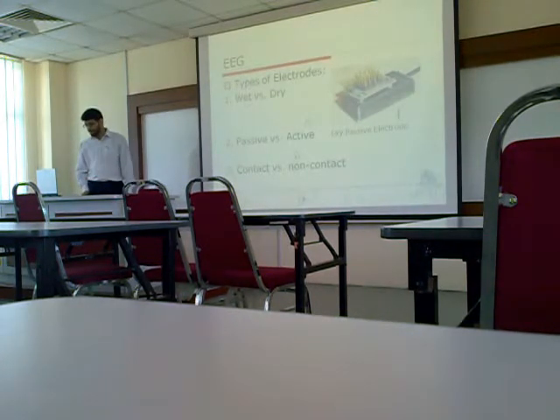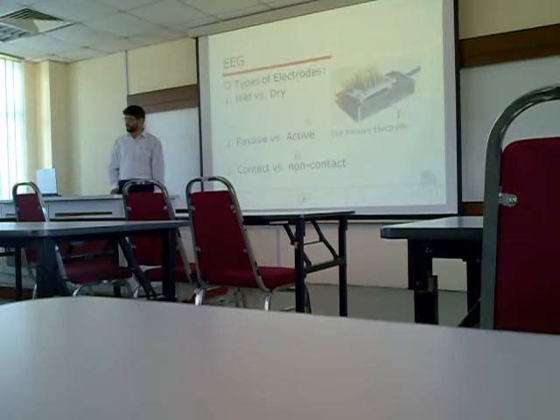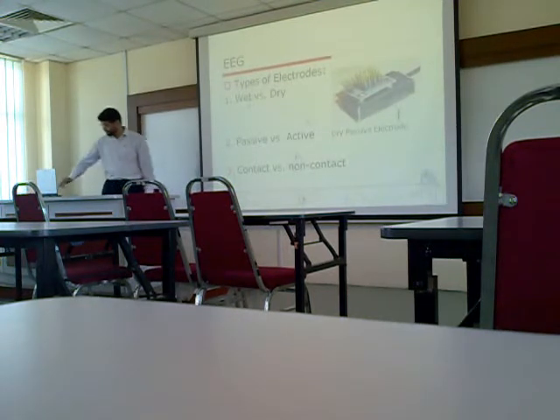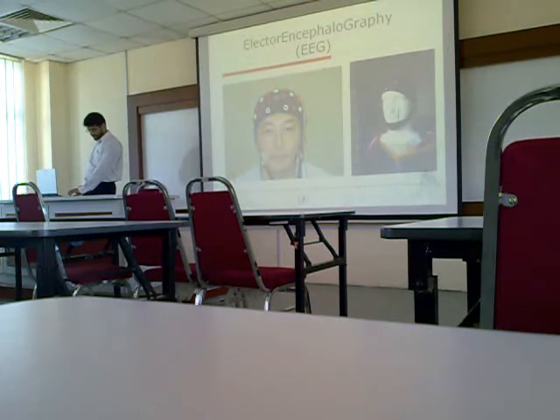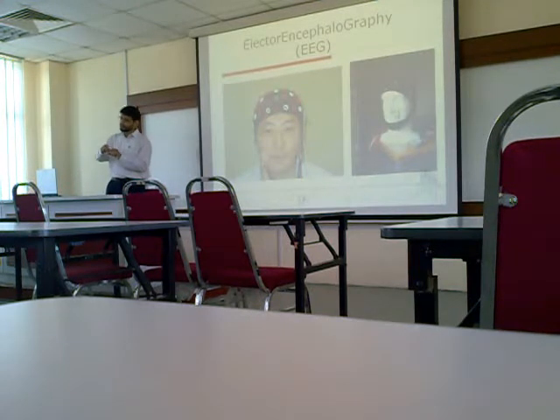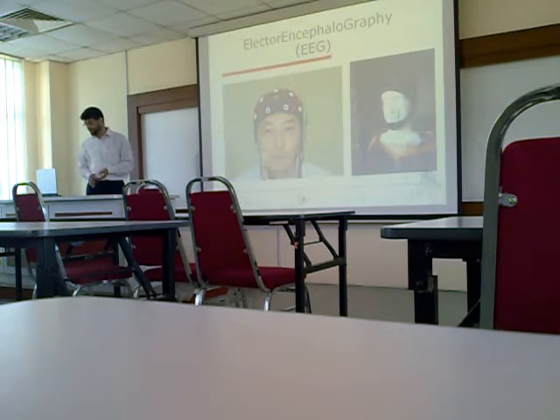As for the types of electrodes used for EEG, in the previous slide you can see that at every node there is an electrode, and they put some conducting gel underneath the electrode, so that the hair will not isolate the electrical signal.